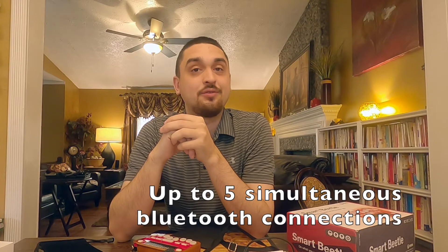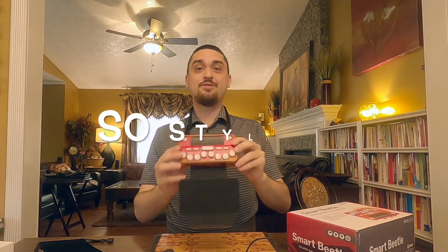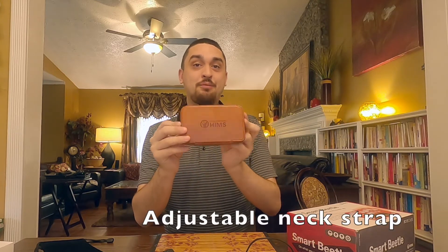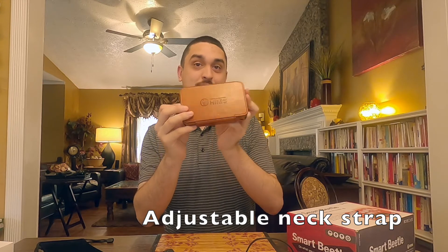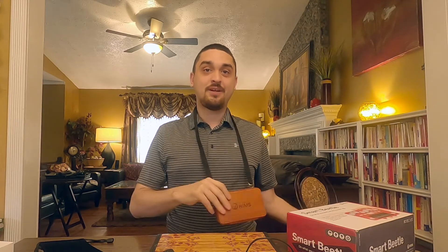It's very light, very portable, and it can have up to five simultaneous Bluetooth connections. And, as you can see, it's very stylish. If you do not have it open, people would probably assume this is a purse or a small cell phone carrier. But very stylish, very retro.